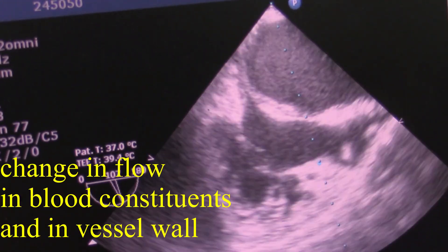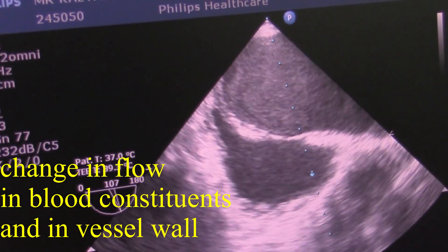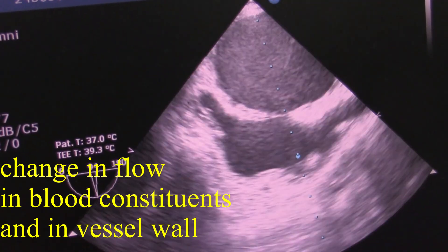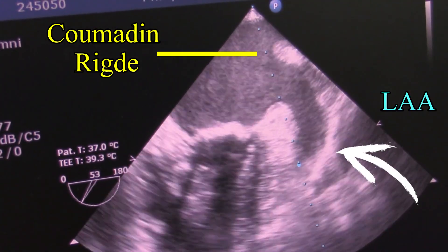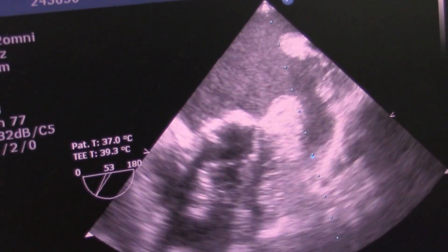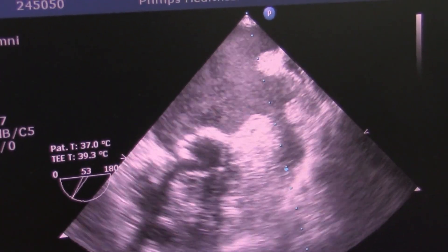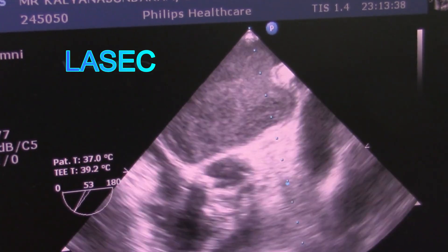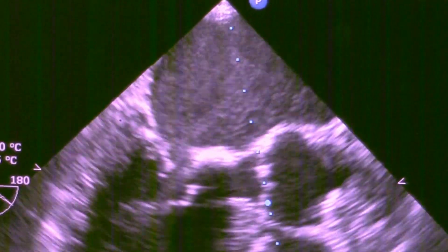These red cell aggregates tend to reflect ultrasonically on transesophageal or transthoracic echo and is called left atrial spontaneous echo contrast. The other requirement for the blood to swirl within the left atrium is low velocities of blood flow. In severe mitral regurgitation you will not see left atrial spontaneous echo contrast because the velocity of blood flow is quite high. If you do see it in severe MR, it indicates a case of severe MR with very poor LV function.